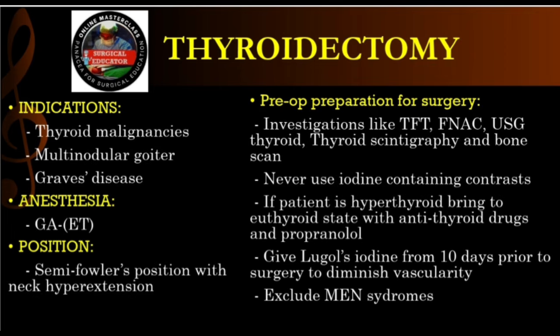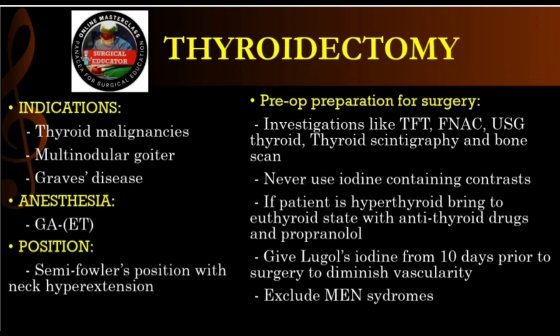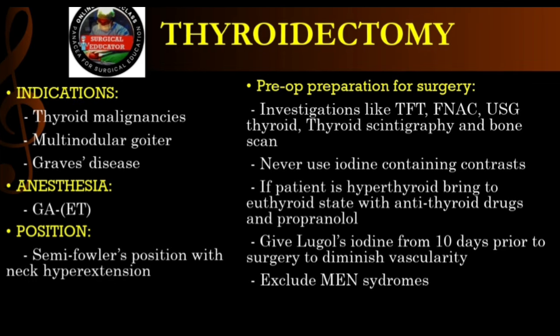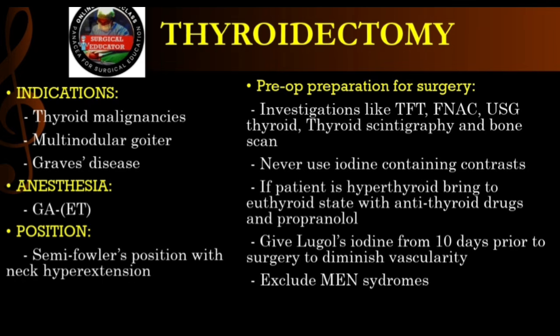But regardless of whether it's structural or metabolic, the anesthesia plan is non-negotiable, right? Completely non-negotiable. General anesthesia with endotracheal intubation, period. GAET. I always picture the endotracheal tube as the scaffolding of a building you're renovating. That's a great analogy. Right. You wouldn't knock down load-bearing walls without temporary supports. And in the neck, you are scraping tissue right off the trachea. You cannot risk the airway collapsing.